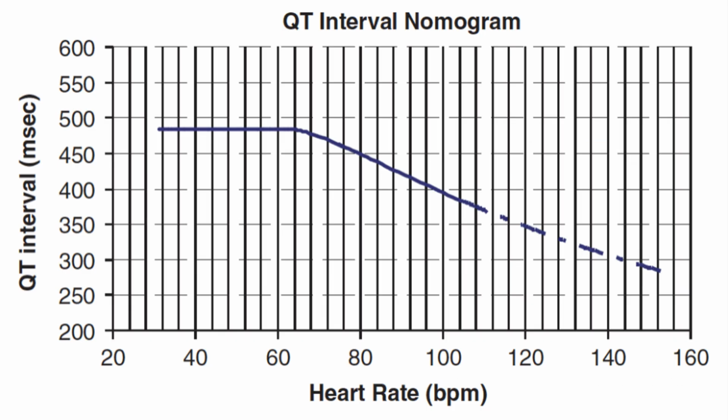Talk about torsades, this brings us into a good point of also talking about the QT nomogram. So this line that we are seeing here in this graph demonstrates the risk of patients going into torsades. Any QT interval above this line shows an increased risk for torsade, while anything below this line shows that there isn't too much of a risk of the patient going into torsade.